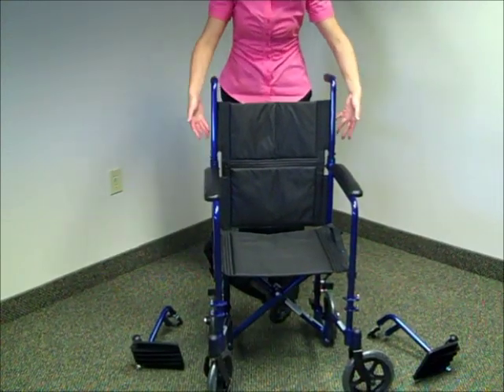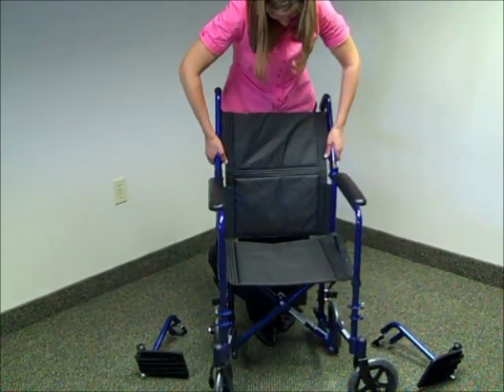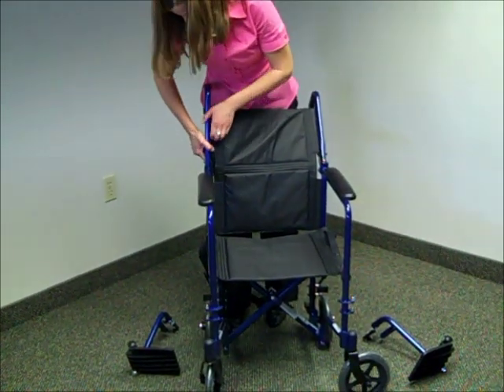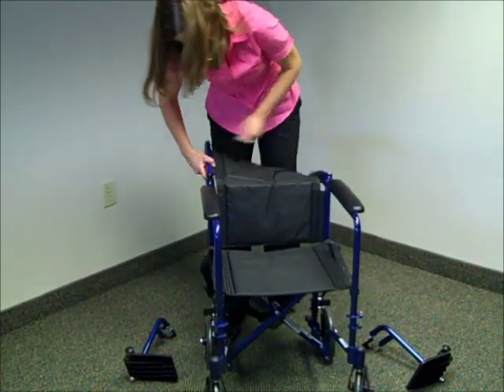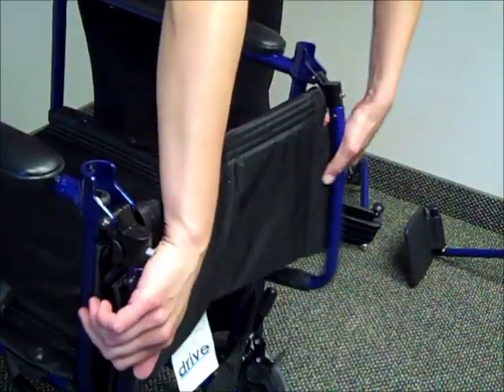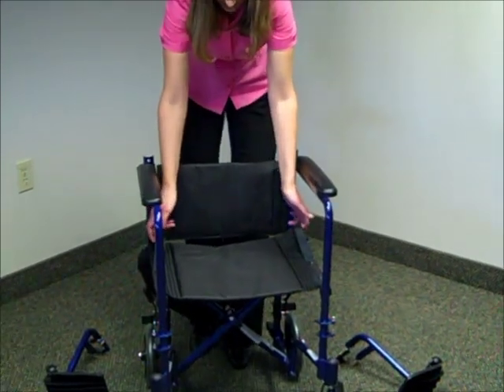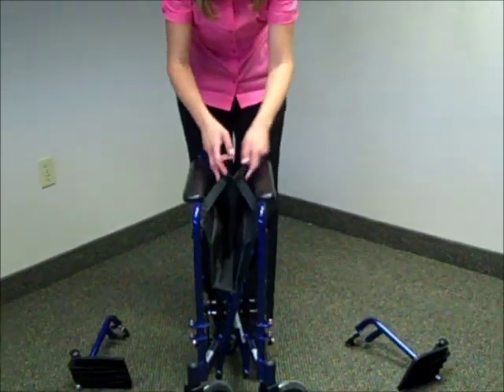Next, we want to fold down the back of the seat, so we're going to grab onto the black levers and fold those down. You'll notice there are two handles on the seat — pull up and the chair will fold.